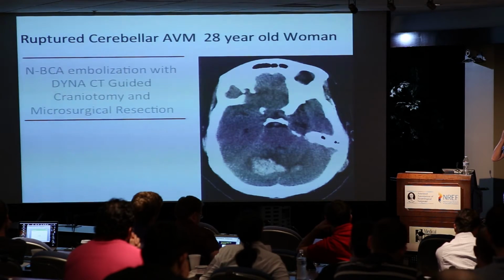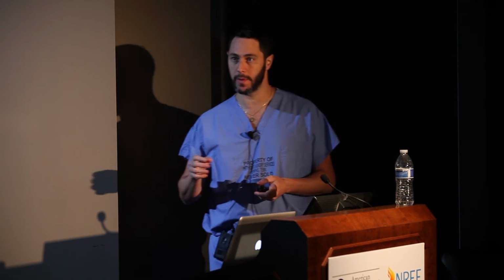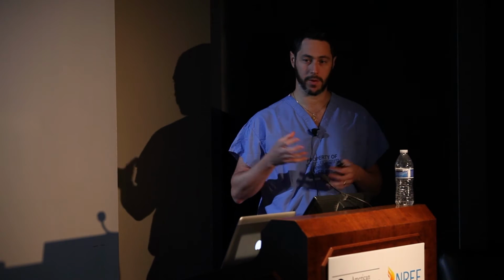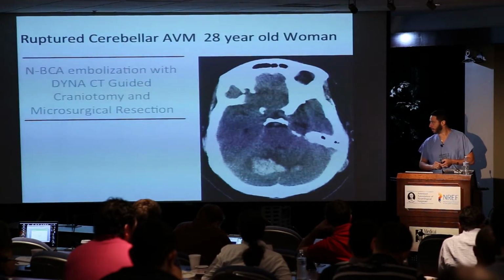A little bit similar but different technique, and I guess I should point out a little bit about the glue dilution on the last injection. I don't want it to go very far. I'm right on top of the problem, so I'm happy with the 50% dilution, 1-to-1. It's going to set up quickly, and I just get my microcatheter out of there. I don't want it to fly. I just want it to fill that balloon.